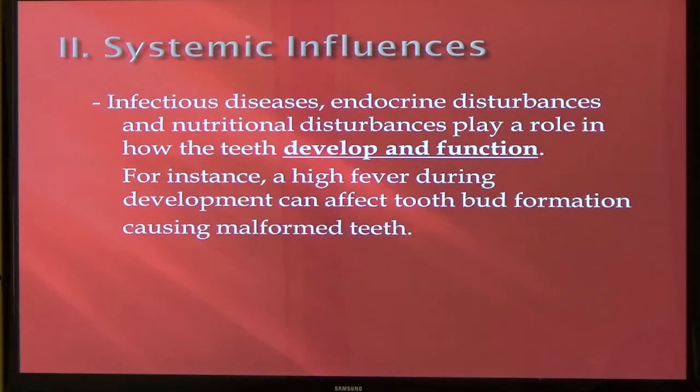And when it comes in, it's going to be in the wrong spot, or it's going to be too little. I think somebody has a peg lateral. Yeah. So a peg lateral here, we have Vanessa, I've seen. Luckily, it's in the right spot, and that's easy to correct with a veneer or a composite.